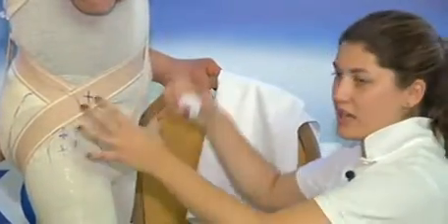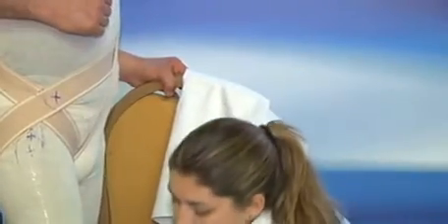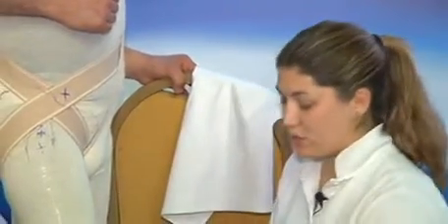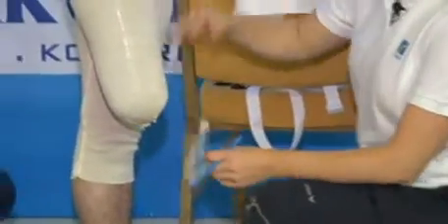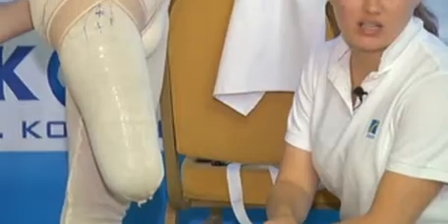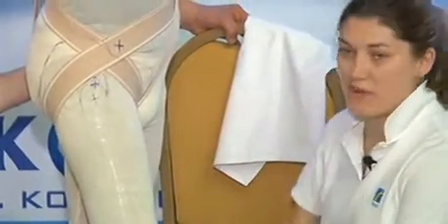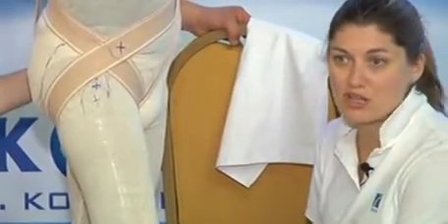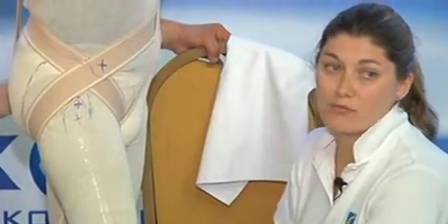Okay, so it's just an idea. At least I know what I'm covering when I'm casting. Now, when we do any sort of suction or passive or active vacuum, we of course need to take measurements. Well, pretty much for any cast we need to take measurements. I like to take about every 3 centimeters in transfemorals, and that way I can later have a better volume reduction.